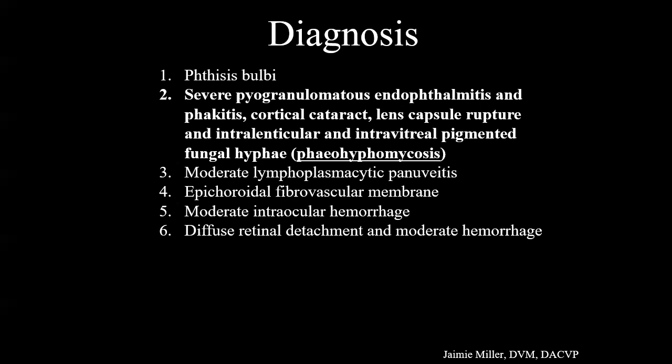So no histoplasma was seen with the GMS or regularly. Doesn't mean it's maybe not there if there's antibodies to it, or it was there in the past, maybe. I'm kind of skeptical. I think we actually talked about it here, how the antigen and urine antigen and antibody tests for fungal organisms, when they're related to the eye, there's a lot of cross-reactivity.